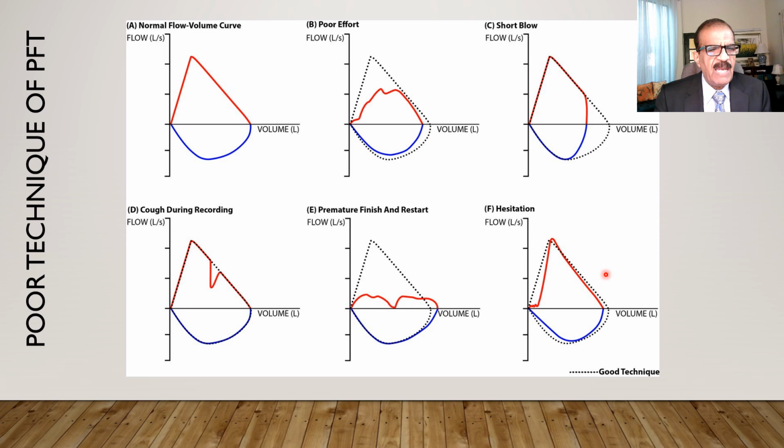And you know, sometimes we see all types of patients. Patient is usually nervous, and may not be very comfortable doing the test, and sometimes patient may be doing it intentionally. In forensic medicine, we have learned that sometimes patient will do it intentionally for one or the other reason. So beware of these faulty results.